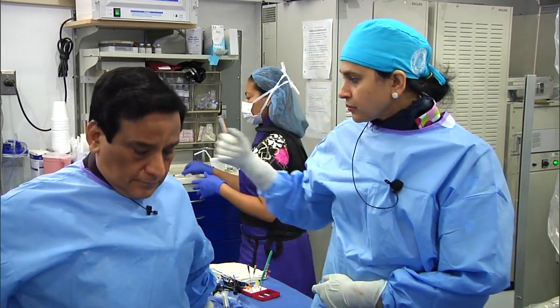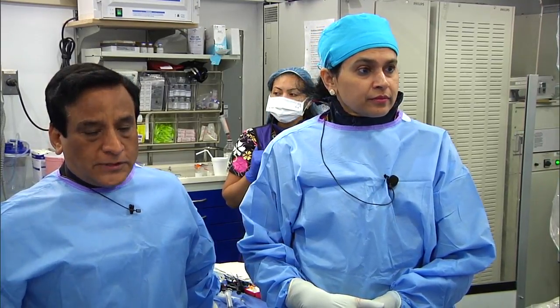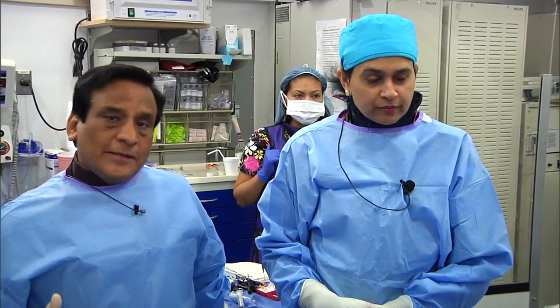Samin, quick question. Was the previous attempt of PCI of the RCA done at Mount Sinai? Yes, it was done at Mount Sinai. They were concerned about doing a rotablation in the setting of myocardial infarction. As we have published, even for some calcific lesions in acute coronary syndrome, non-STEMI, and rarely, we have done a handful of STEMI patients because nothing else will go, you advance the RotaWire and use 1.25 burr. But there was reluctance, and we could have done it a few days later, but the patient was okay on the balloon pump, and we stopped at that point.